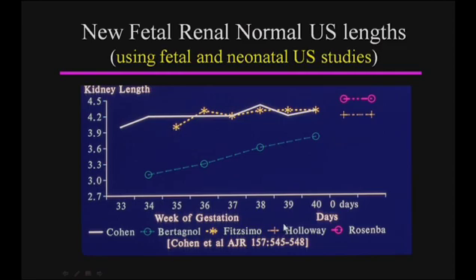Those measurements, placed against our measurements in fetuses, showed them to be similar and allowed us to know that our measurements were more correct than the measurements used in the past, which is seen in the lower line.